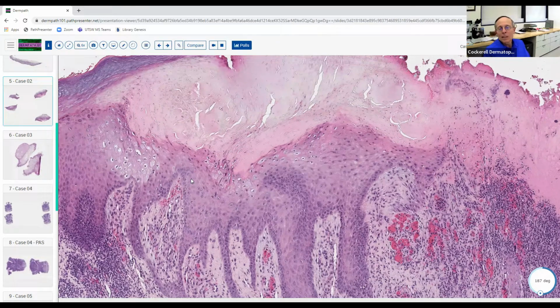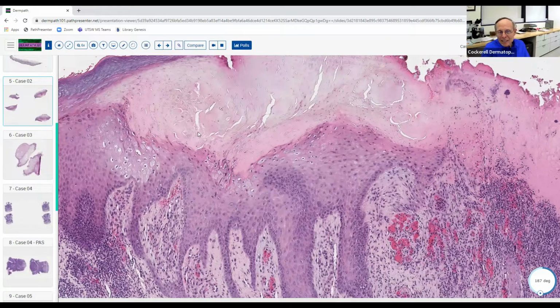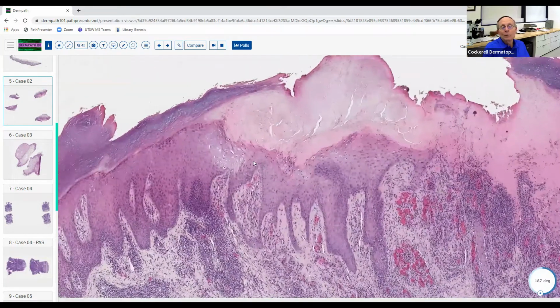The only one that looks a little bit different is cytomegalovirus. If you get a ballooning degeneration of those cells, it's usually just a few individual cells. They're not usually involving the epidermis. Those cells usually involve endothelial cells and fibroblasts in the dermis. Occasionally they can get into the epidermis. Hand, foot, and mouth disease, Coxsackie virus, can also give you ballooning degeneration. Usually though, you don't get this massive amount with this prominent acanthosis. It's just a small focal area. It would kind of look maybe just like this area if it were CMV. So that's another virus that can give you ballooning degeneration.